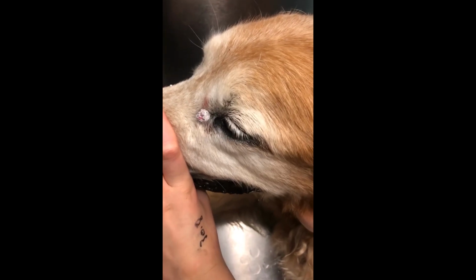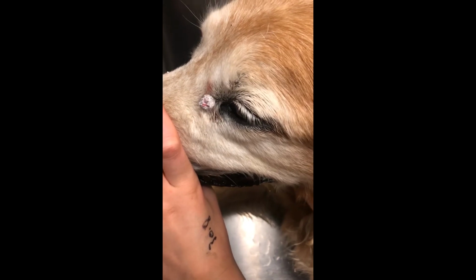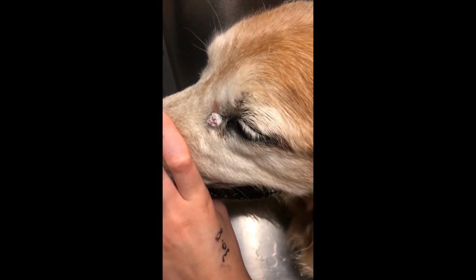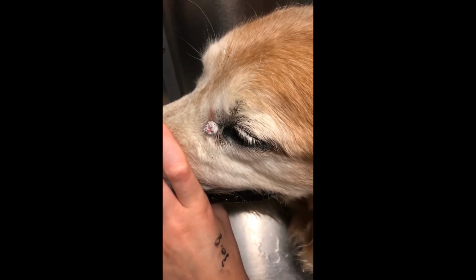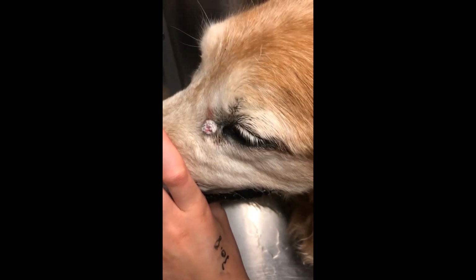So, post-second freeze cycle, we typically send these dogs home without any medication whatsoever, and the lesions typically dry up and fall off within the ensuing 3 weeks. On a rare occasion, there are some residual areas that need to be refrozen, and I typically do those at no charge to the client.